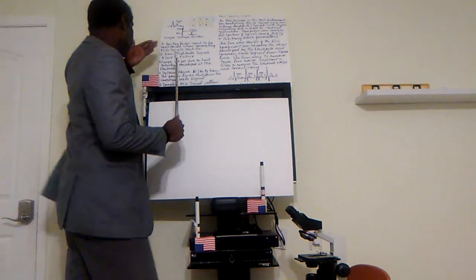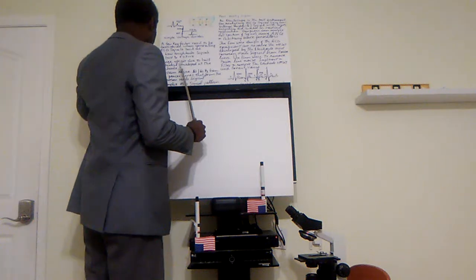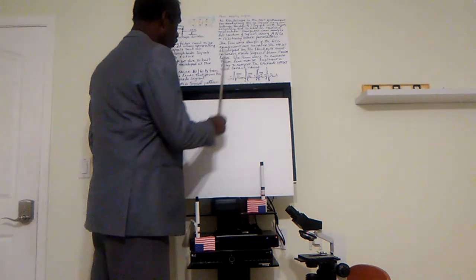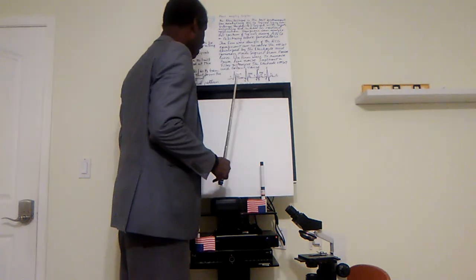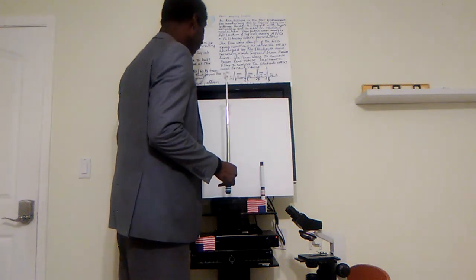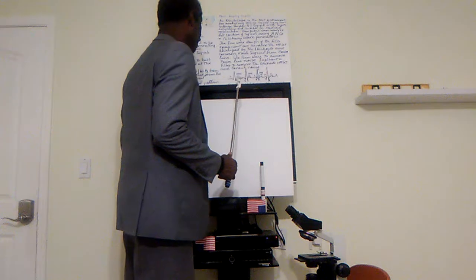So you see most of these key factors, problems that occur in generating the ECG signals, can be removed or reduced to near zero by the firmware designer of the ECG, using the arbitrary wave generators and filters, implementing filters to remove the electrode offset and correct noise.